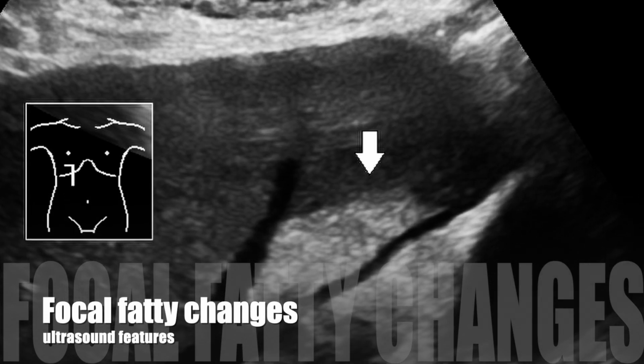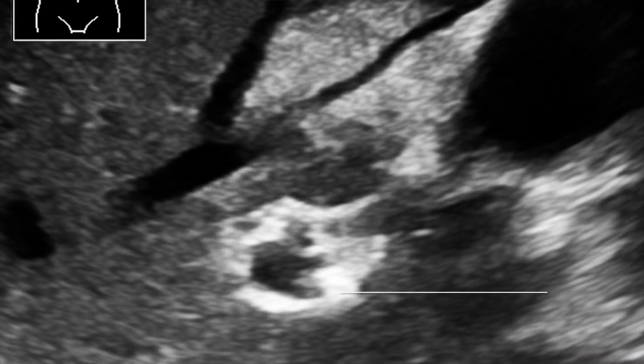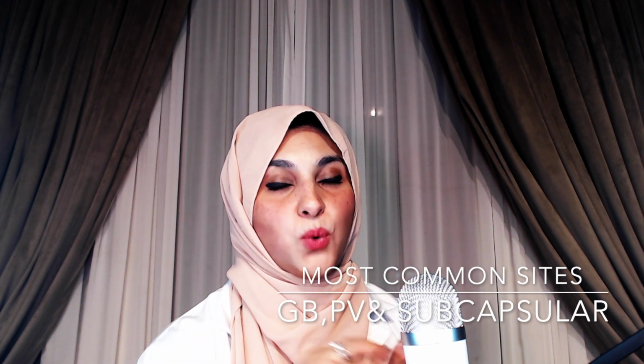Number 3 is the visualization of the posterior portion of the right lobe of the liver, because of the sound beam attenuation. It is normal in grade 1 and 2 with no visualization in grade 3. The other form of fatty infiltration can be seen more focal. So there is another type of fatty infiltration called focal fatty infiltration. Now, the most common sites of the focal fatty changes are near the gallbladder, the portal vein, and subcapsular. They are usually very sharply outlined, with a geographical or wedge-shaped pattern, normal intervening hepatic parenchyma, and no space-occupying effect.